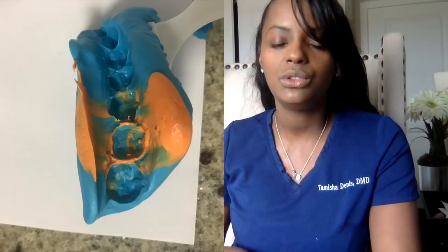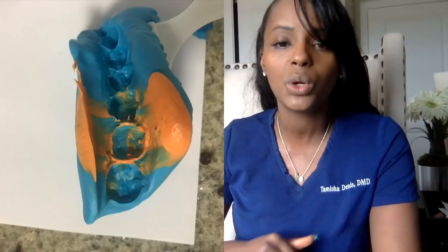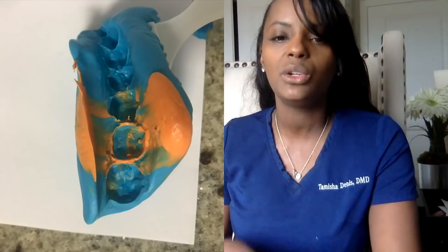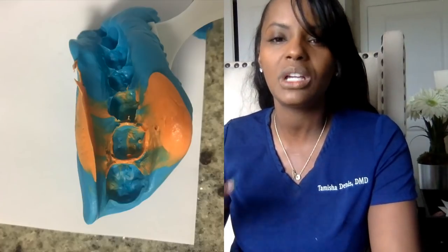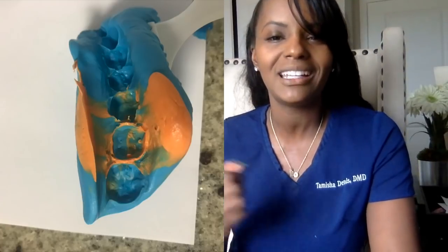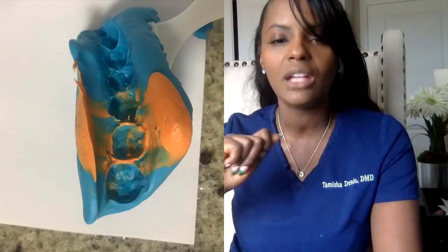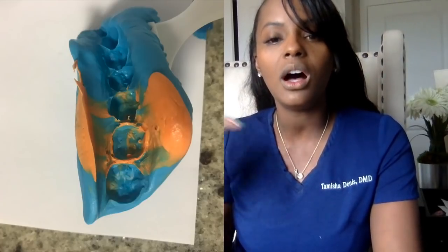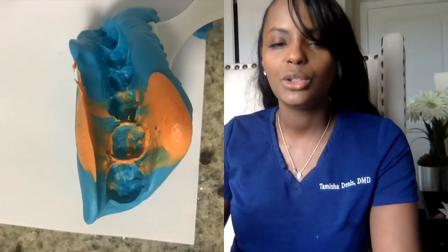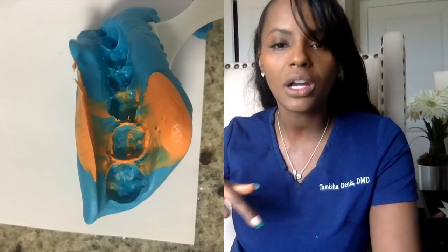After that point, what we do is take an impression. Some dentists will pack a little cord — we call it a retraction cord — to push the gums down in order to get a really nice mold. We use two kinds of material: one thicker material, one lighter material. We call it light body and heavy body. Then we just have you bite down on this material so that it can make a mold of the tooth. You'll see on the other side an impression of the tooth and where what we call the margins are.